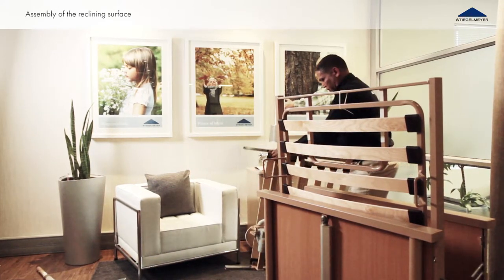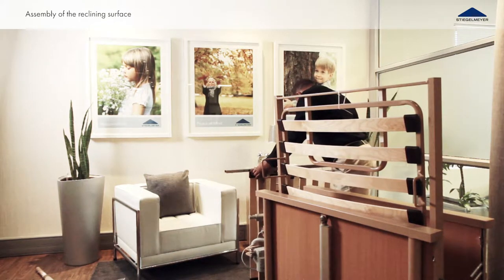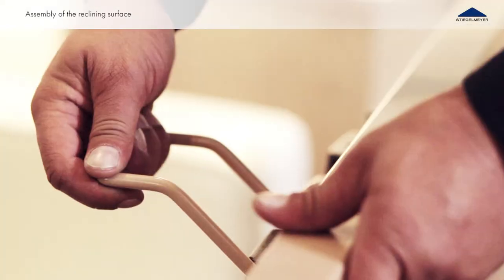Put the head side half of the reclining surface frame horizontally on the floor. The two sockets pointing upwards, fold the backrest away from the bed frame.